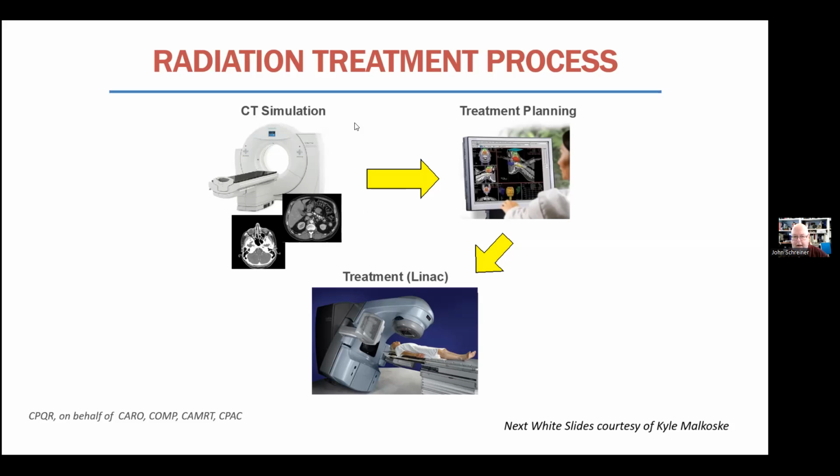I should be a little bit careful and say these beams are at slightly different energies, so there are some corrections that one has to do. But again, the physicists have contributed to the design of this process, and have made sure that the information is put across appropriately, so that a computer system can be used to plan what the radiation delivery should look like.